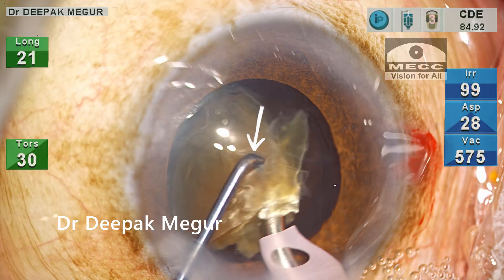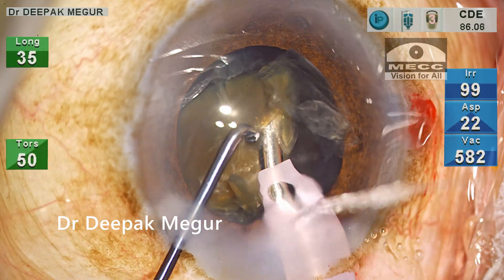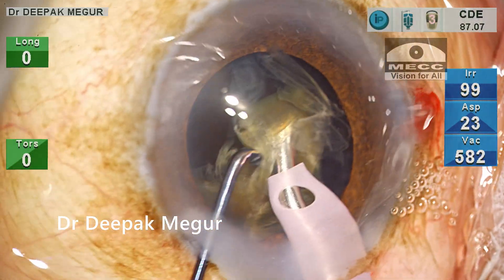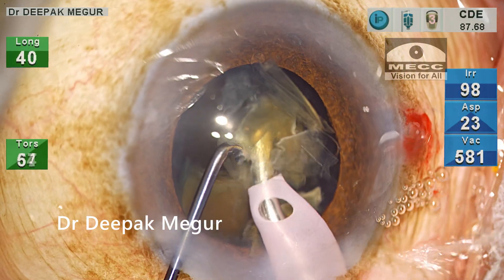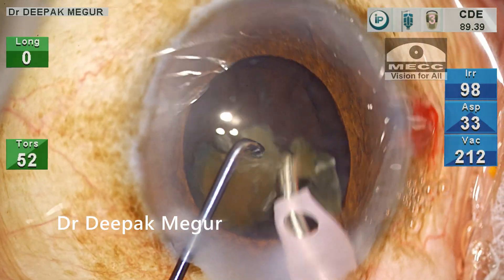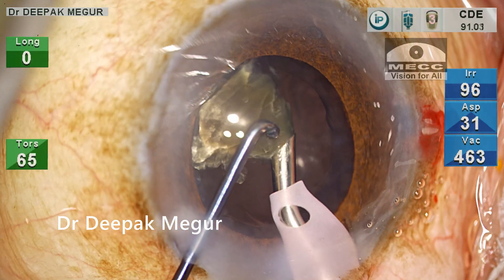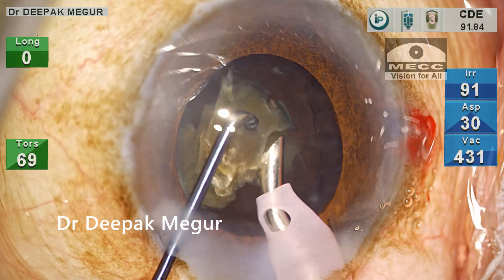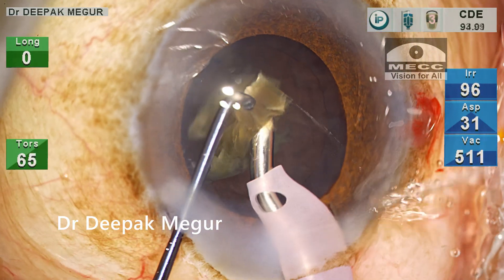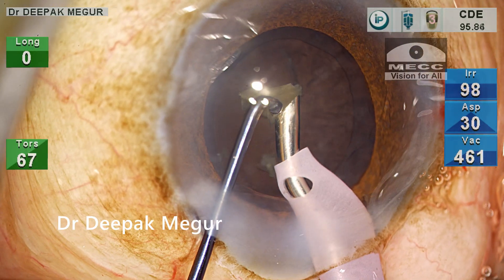My chopper is just above the phaco tip to prevent any fragment from flying up and hitting the endothelium. The only trick to such control is to go slow — using lesser energy minimizes lens chatter and turbulence. The energy is controlled via the foot pedal. The price we pay for this control is time; this case took almost three times longer than a routine case. Using maximum power could emulsify fragments in seconds, but the consequences are higher lens chatter and turbulence, resulting in mechanical trauma to the endothelium and post-operative corneal edema. By going slow, most things are under control, and the final fragment is out.